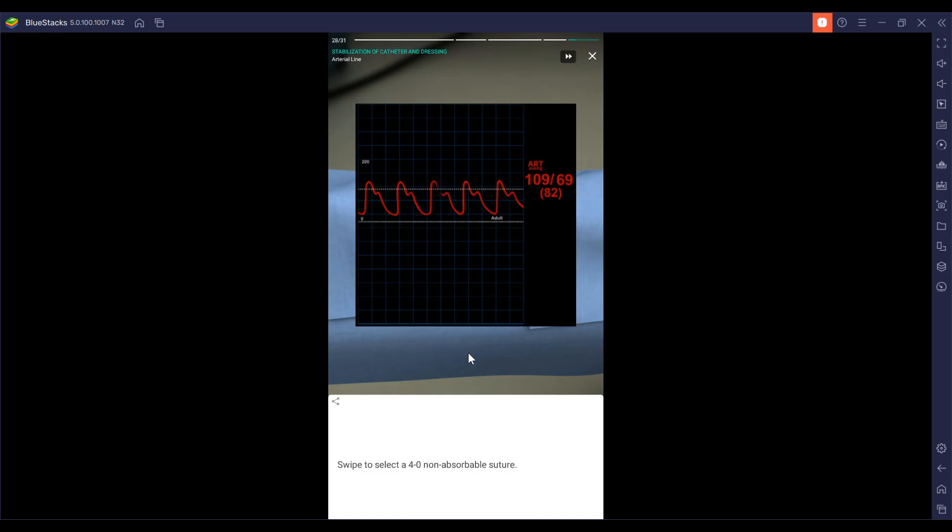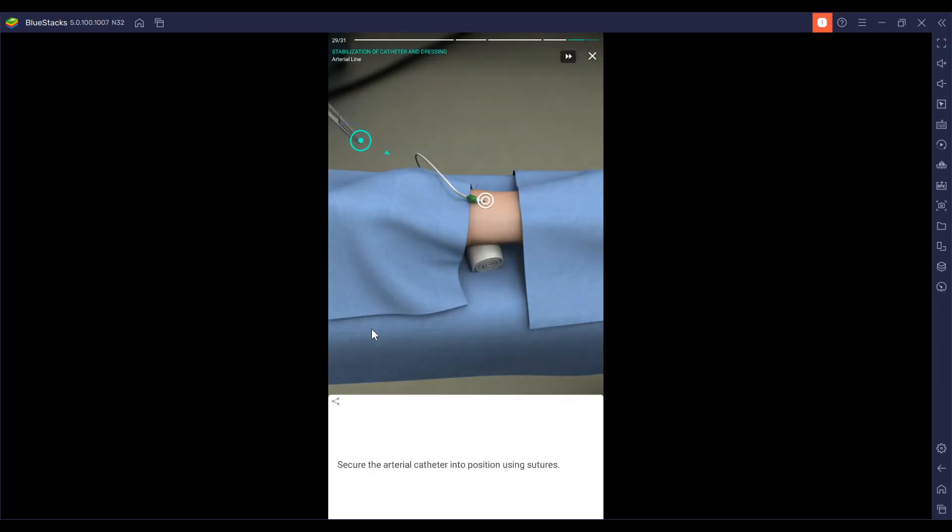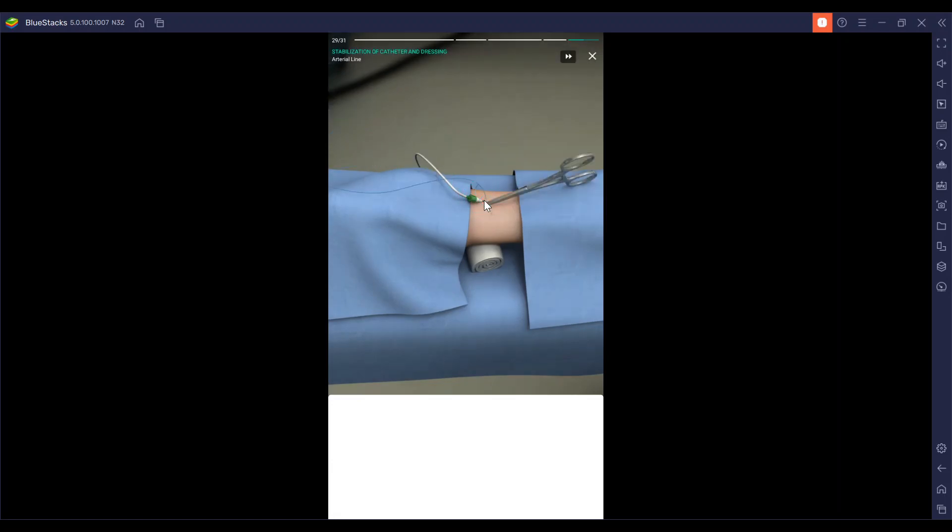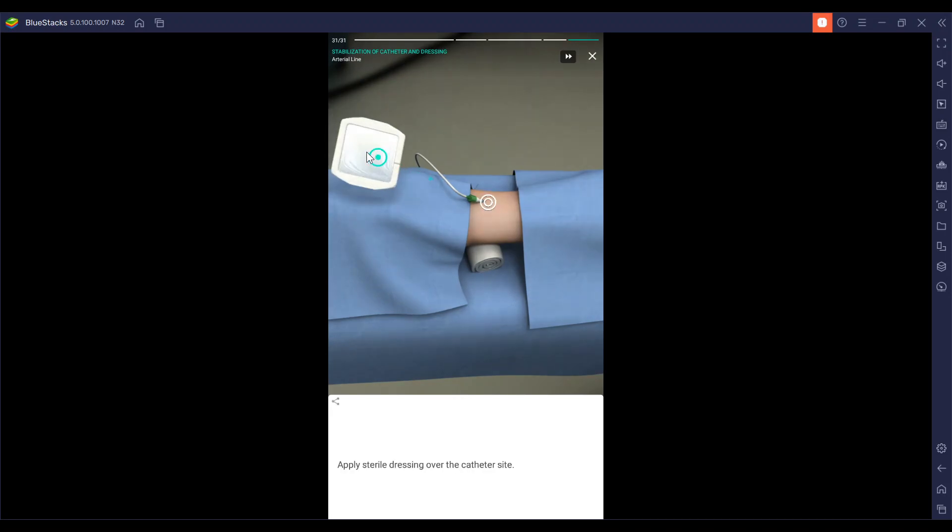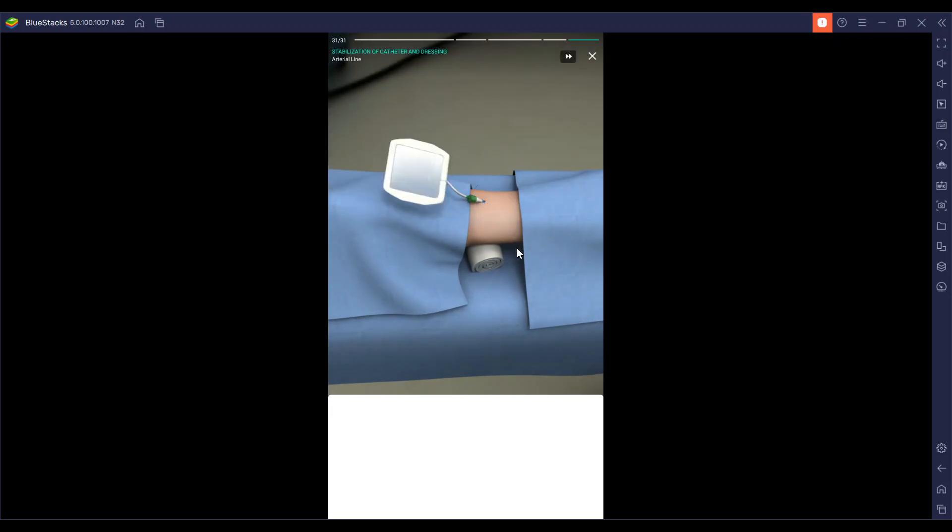So right there. We're going to do 4-0 non-absorbable sutures for the placement of this catheter and do that sterile dressing and place it directly over that site.